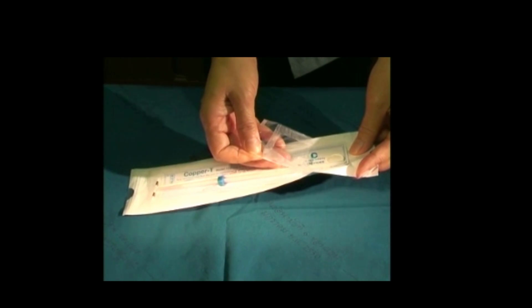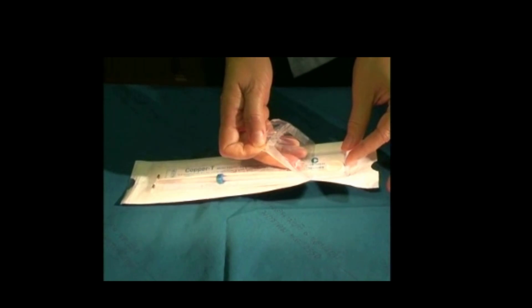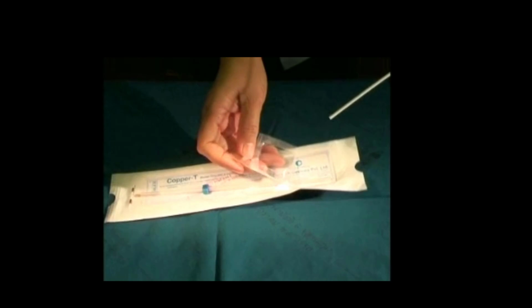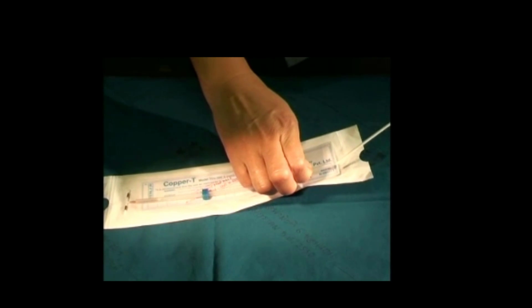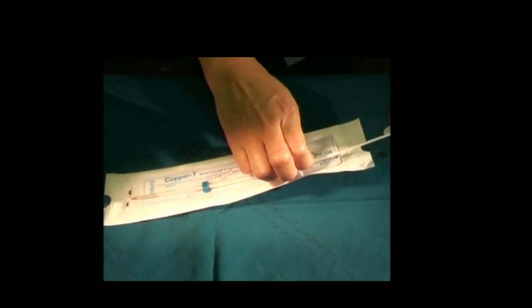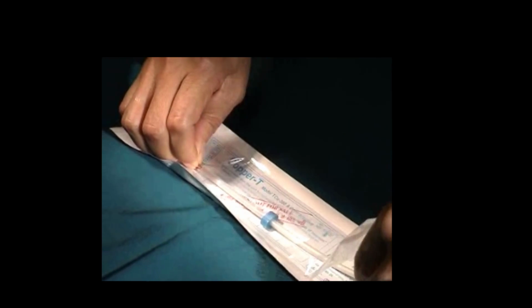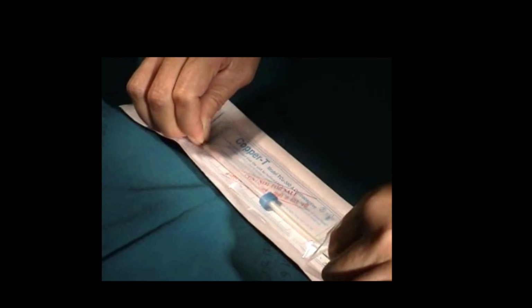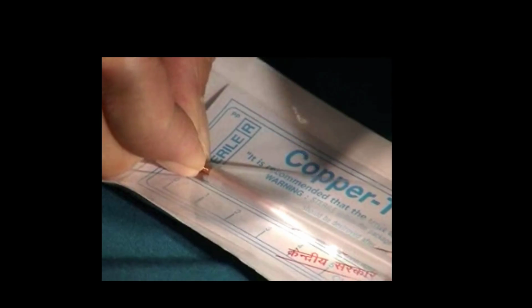The copper T380A IUD comes with its inserter in sterile packaging. Using the no-touch technique, load the IUD into the inserter while both the IUD and the inserter are still in the package. Here is how it is done. Pull the inserter tube to let the IUD lie freely in the loading capsule. Then, by squeezing on the sides of the loading capsule, bring the horizontal arms of the IUD close to its vertical body. Now push the inserter tube forward to capture the body and the two arms of the IUD in the inserter tube.